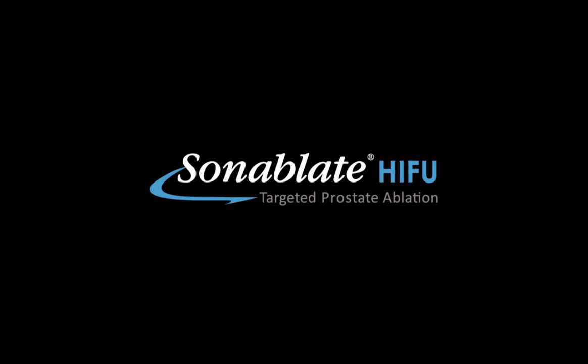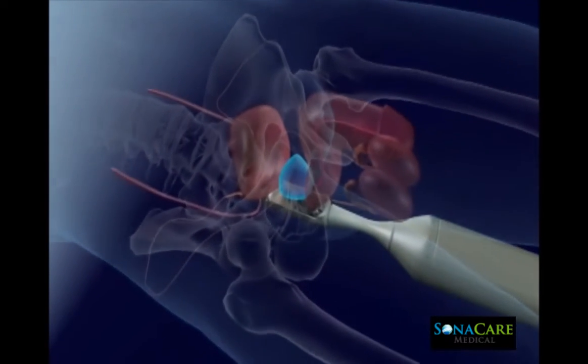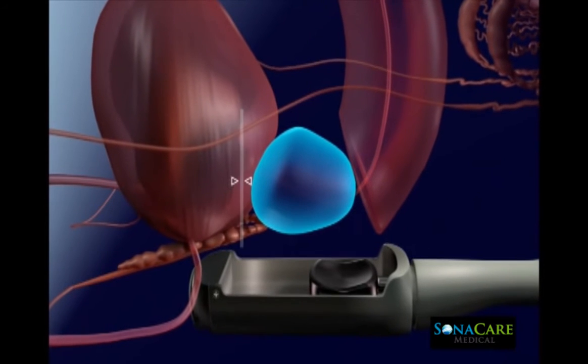The Sonoblate system is a physician-guided robotic device that is FDA cleared for transrectal high intensity focused ultrasound ablation of prostatic tissue. High-intensity focused ultrasound or HIFU is delivered via a transrectal probe that is securely positioned in the appropriate anatomical orientation at the beginning of the procedure.